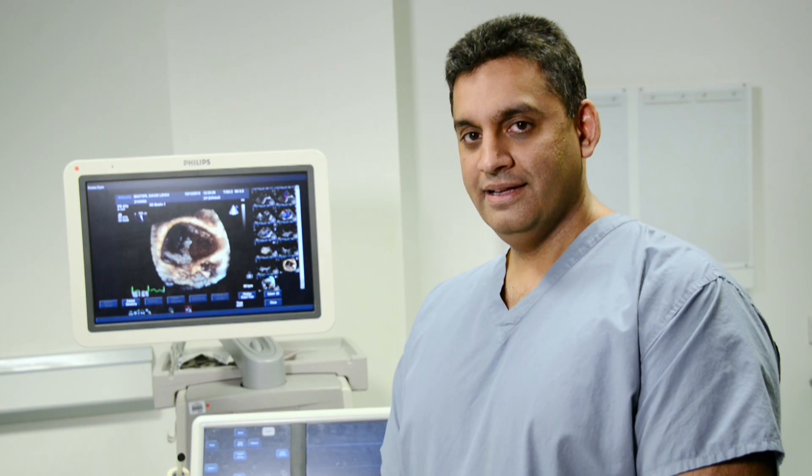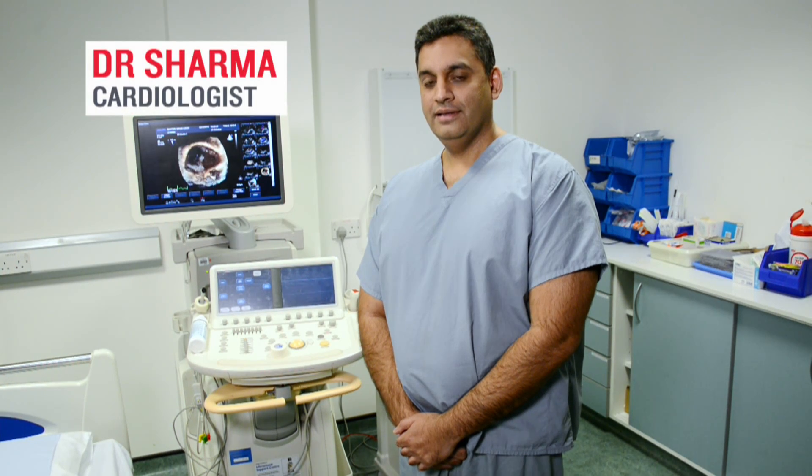A little bit nervous. I'm Dr Raj Sharma, consultant cardiologist at St George's Hospital and I'm also the director of cardiac, or heart, ultrasound.